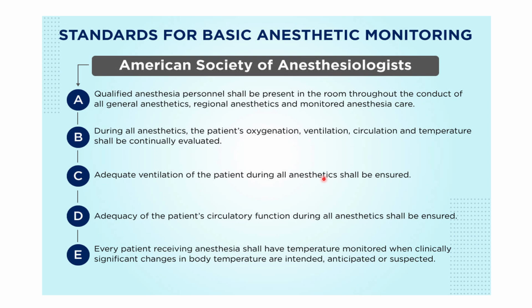But after 2 or 3 minutes, you ask the surgeon, please let me ventilate the patient to eliminate the CO2 retention that happened during the last period. So oxygenation means giving oxygen to the patient in this operation. You will find this mostly in microlaryngeal operations. If we are not using the laser, we provide the patient with oxygenation. If we are using the laser, we stop oxygenation to avoid burns. Okay?